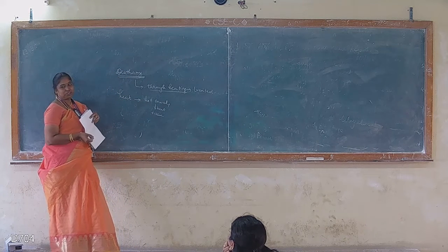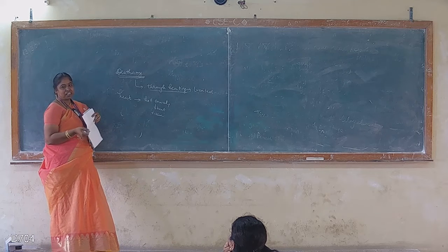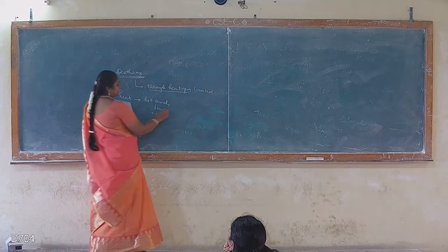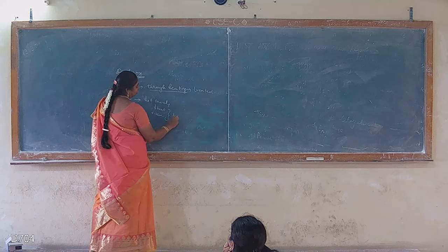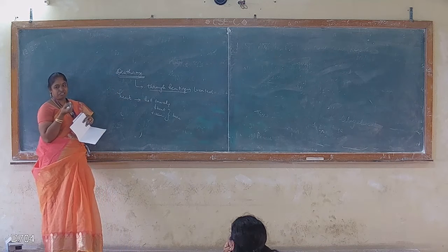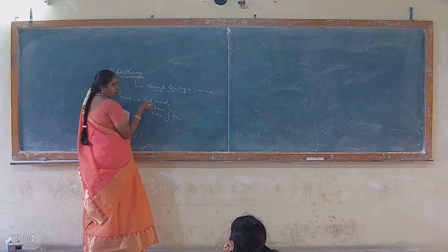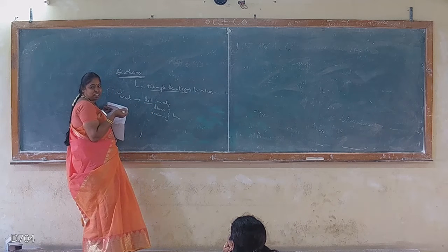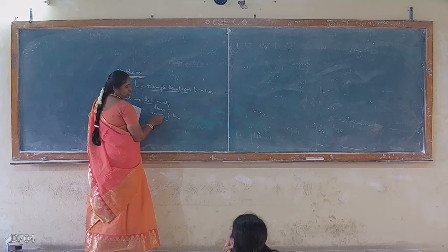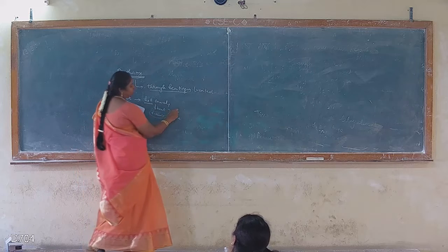But what always happens whenever we apply a hot towel or any hot material over the human body muscles or tissues is that the area can be burned by the application of the heat. For example, when we apply a hot towel over a swelling, if the heat is too much, the muscle tissue can get burned because of the overheat.